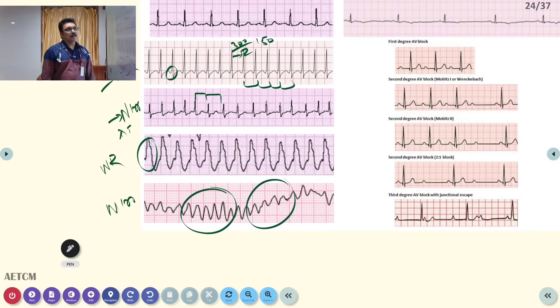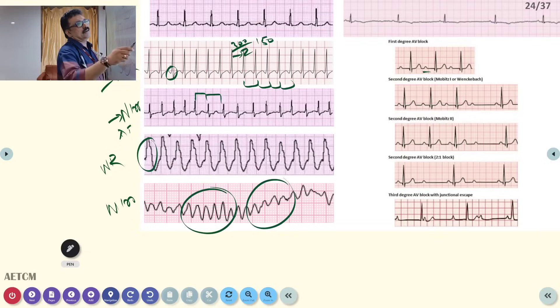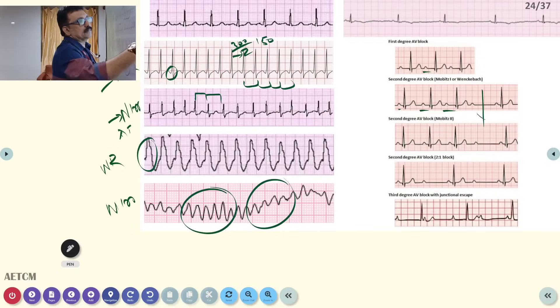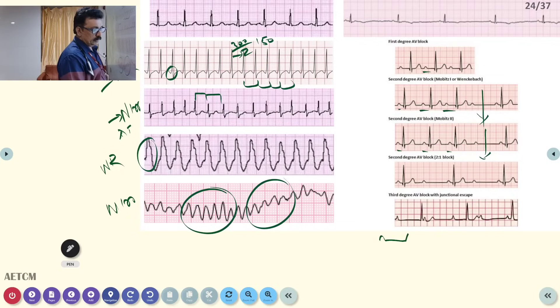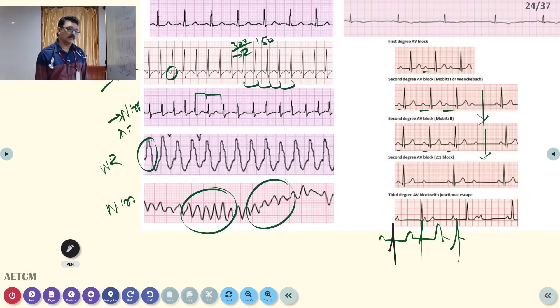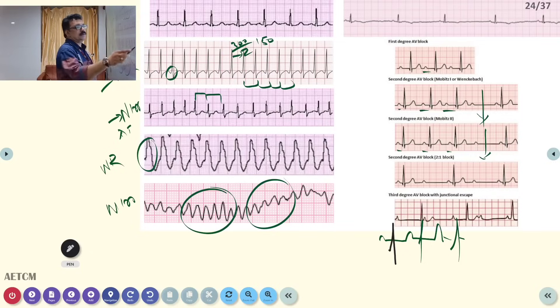Brady arrhythmias include different degrees of heart block. First-degree heart block shows a prolonged PR interval. Second-degree Mobitz type 1 (Wenckebach) shows progressively prolonging PR interval until one QRS is dropped. Mobitz type 2 has a fixed PR interval with sudden dropped QRS complexes. Third-degree (complete) heart block shows P waves and QRS complexes each with their own regular rate but no association between them — complete AV dissociation.